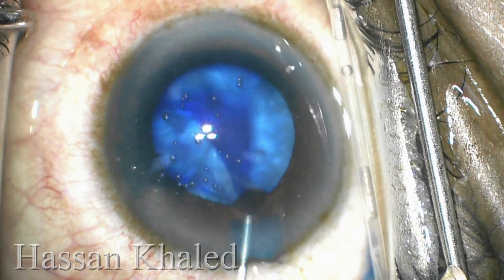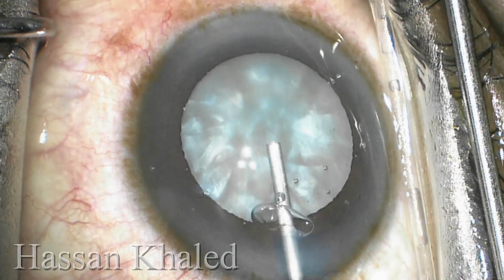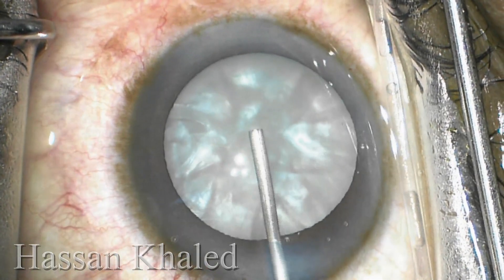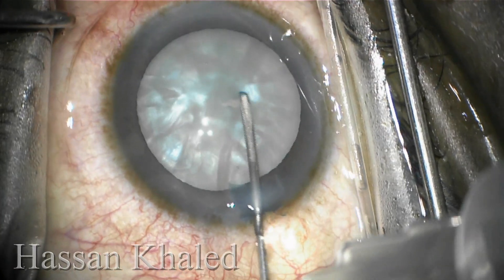Then I continue the surgery by staining the anterior capsule using trypan blue under the air bubble, then injecting dispersive OVD to fill the anterior chamber properly.